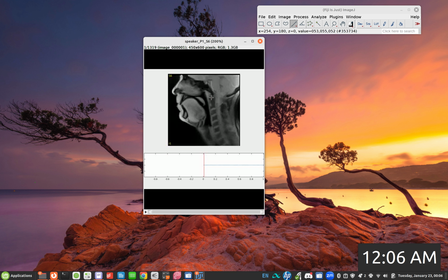As you can see, we're interested in the velum's movement. The velum will rise to close and create a seal against the velopharyngeal wall here. And if you just slide this slider, you will see the velum comes down, then goes up here, especially. So here you can clearly see, oops, I released it. So you can clearly see the velum is moving in a diagonal way, not vertical.